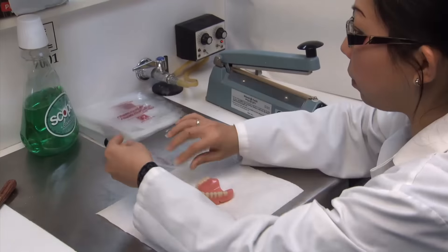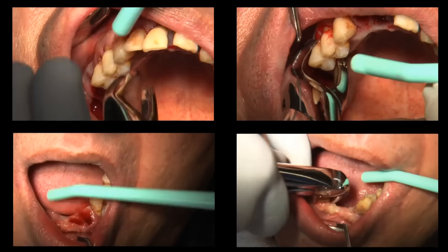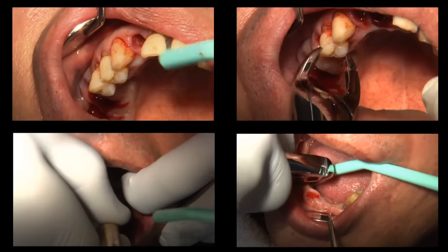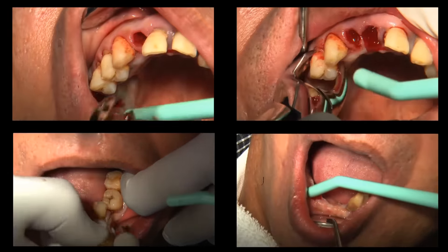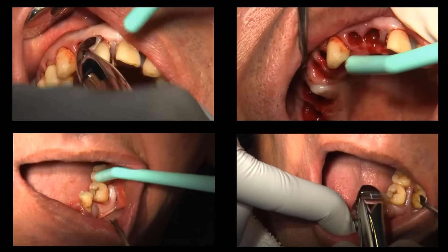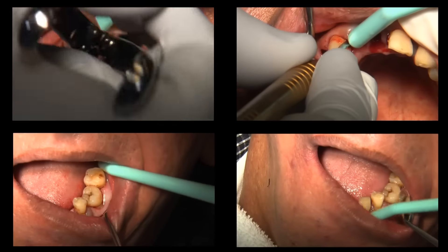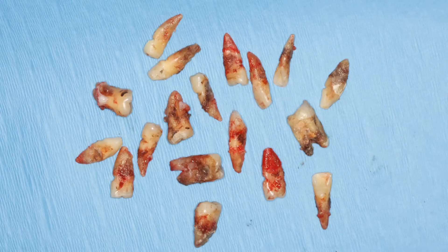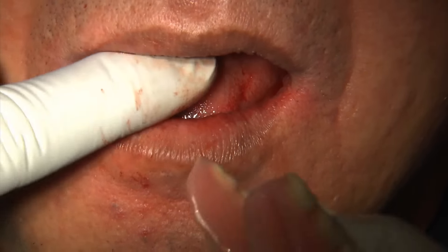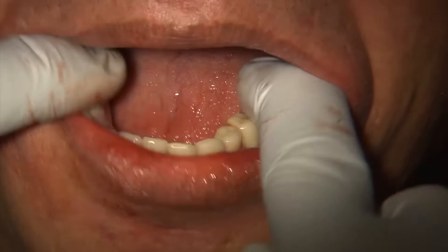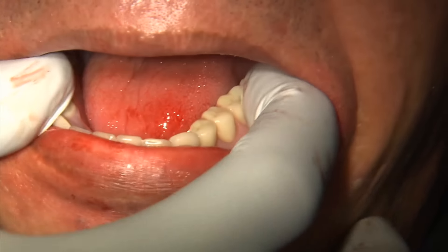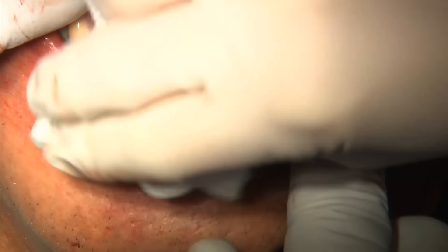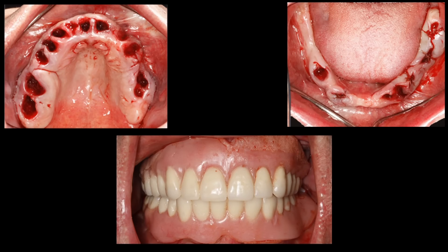The denture is ready and the technician wraps it up and sends it back for the actual procedure. When the patient returns for the second appointment, the extractions are fairly easy given the patient's periodontal condition. The teeth are gently extracted and all sockets are curetted and cleaned. Because most of these teeth were retained primarily by tissue, the healing time was fairly quick as you'll see in the before and after pictures. The extractions are completed and the denture is relined with CoSoft reline material and delivered on the second appointment. The great thing about going digital is not having to worry about extracting teeth during your preliminary impression.